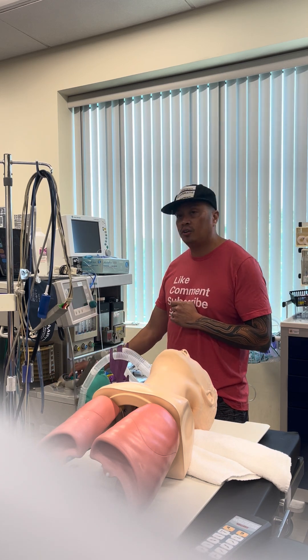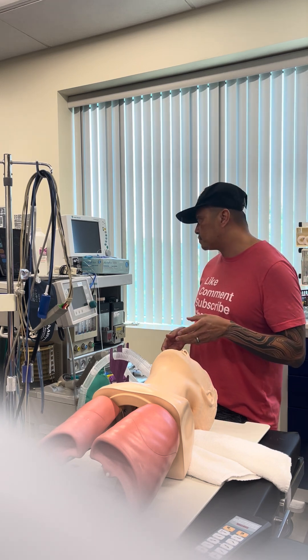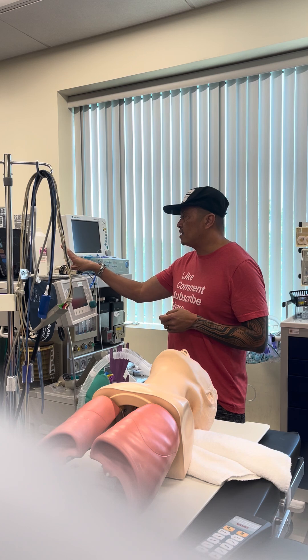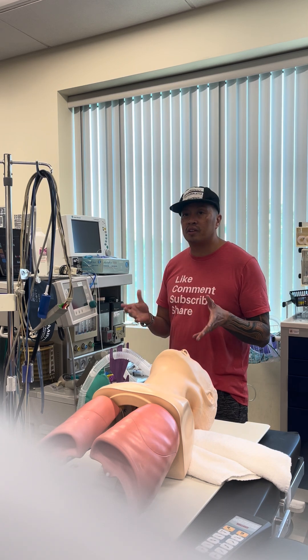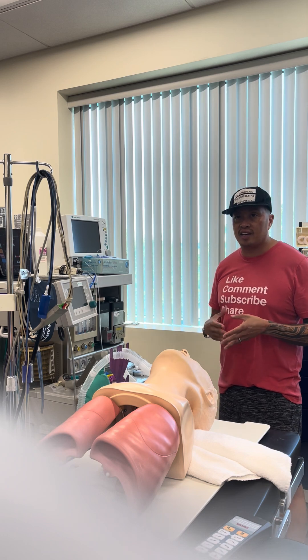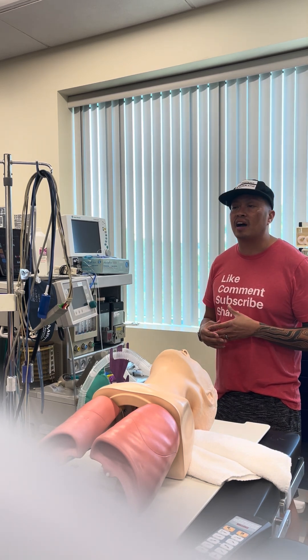Get back down, open my APL. Next, I'm going to check my machine — I have my vital signs machine here and I have my parameters: I have ETO2 greater than 80%, I have my pulse ox greater than 92%, and it's audible.